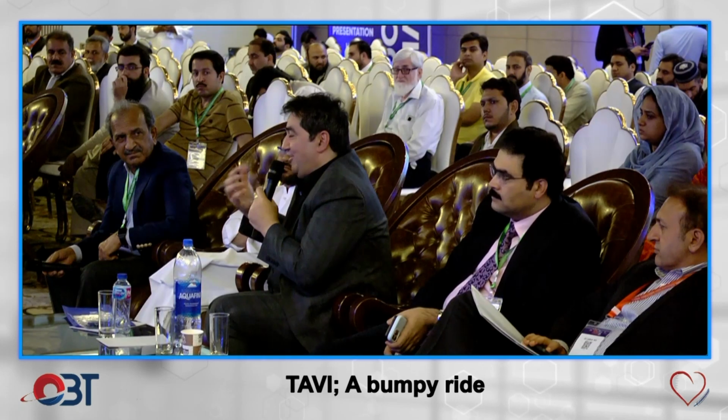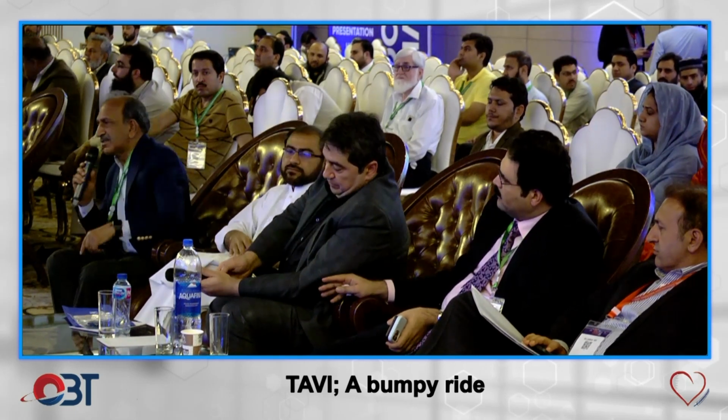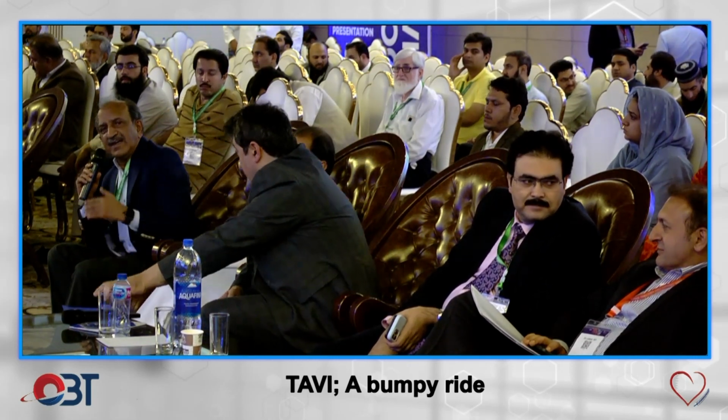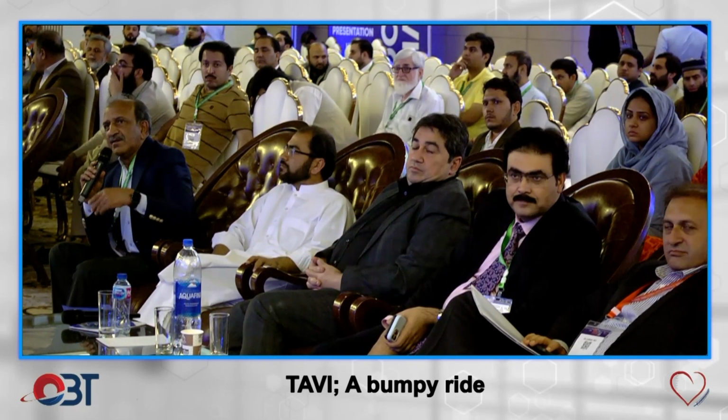Don't balloon twice. It has happened to me in my early days. In future, if you guys are doing it, don't balloon it twice. That's a pertinent point. Just a couple of points. As Dr. Qureshi has said, annulus measurement by echo and the calcium scoring. I think when we talk about the calcium score on the CT scan, it is the basic evaluation. When you are doing a CT scan, you must do this calcium scoring also.